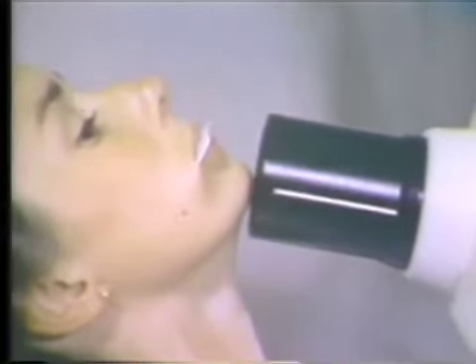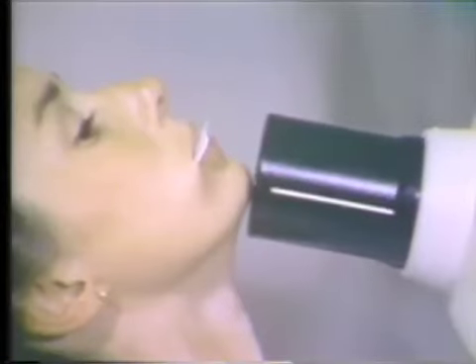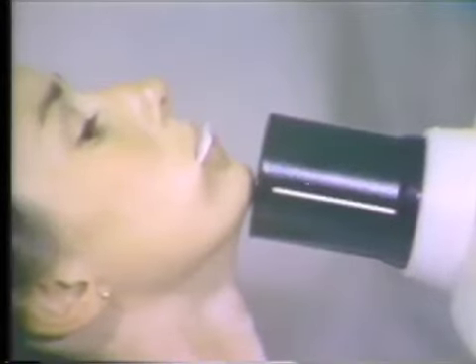Another error is illustrated here. The vertical angulation is incorrect because 10 degrees were subtracted from rather than added to the vertical angle indicated when the central ray was perpendicular to the film packet. This error will cause the teeth not to register in true cross-section.